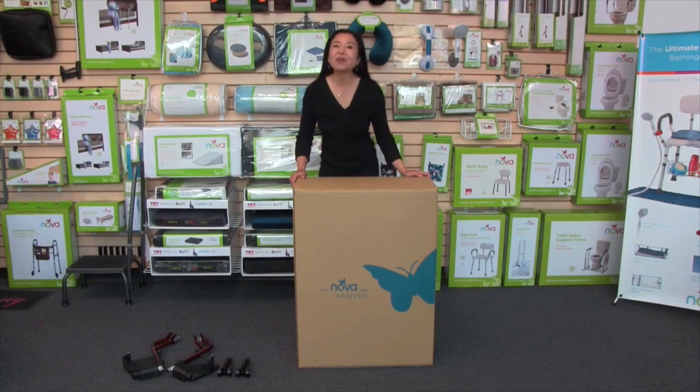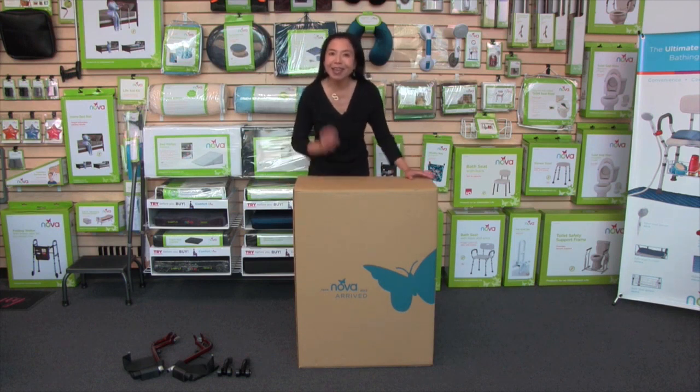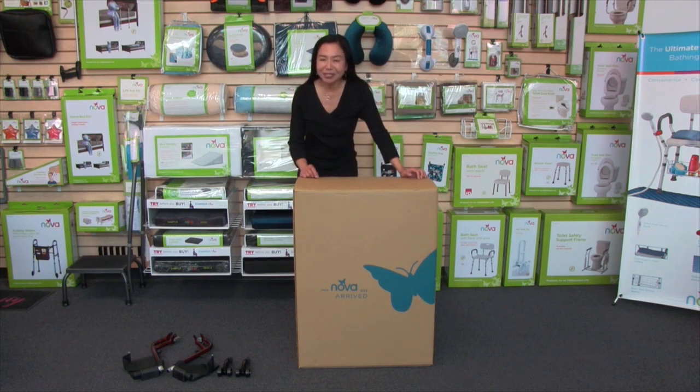Hi, this video is about the Nova Lightweight Transport Chair with removable desk arms. When you receive your transport chair, it's going to show up in a box just like this, and I'm going to show you how to get it out of the box.